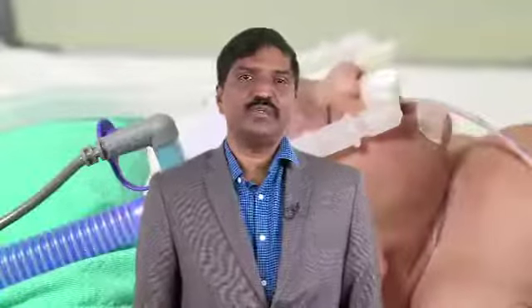The amount of gas coming from the blender is to be set by the flow meter that is fixed to the outlet of the blender. So, the blender is used to titrate the FiO2 of gas mixture and the flow meter is used to titrate the amount of gas mixture that is allowed to flow in the T-piece.